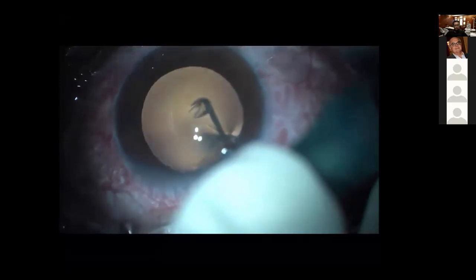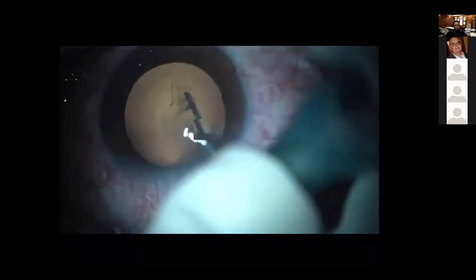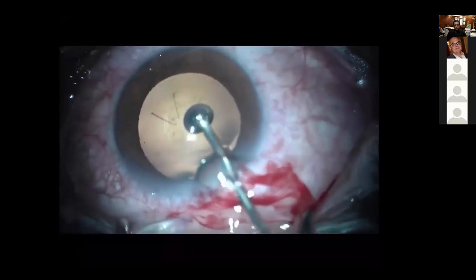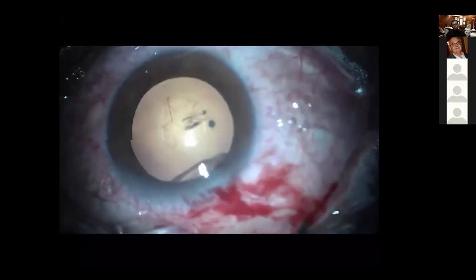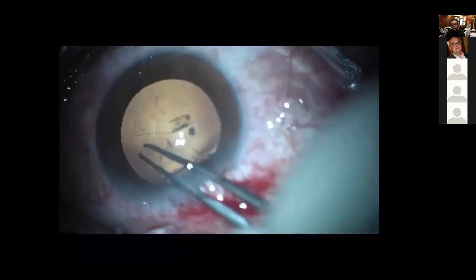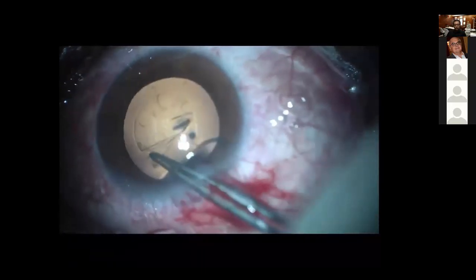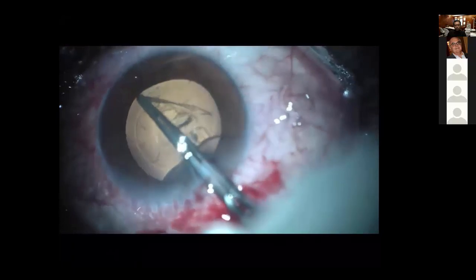And the calculation of the power? How do you divide the powers of the lenses? Do you divide it equally, 25, 25? The lens that is introduced first would be of higher power, and the superficial one would be of less power because in this way it's a little bit thinner. And sometimes you may need to do an IOL exchange in such cases in order to correct refractive errors, and so you need to remove the smaller power lens, which is usually placed in the front, rather than the higher power lens. So I prefer not equal power. I prefer a small power lens in the front and a large power lens in the back.